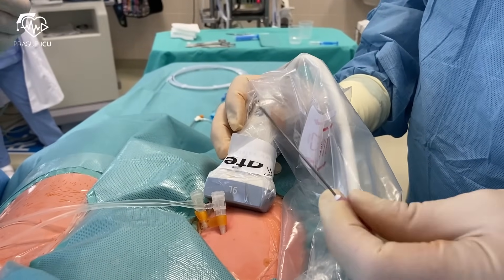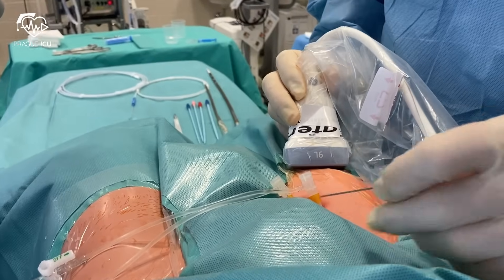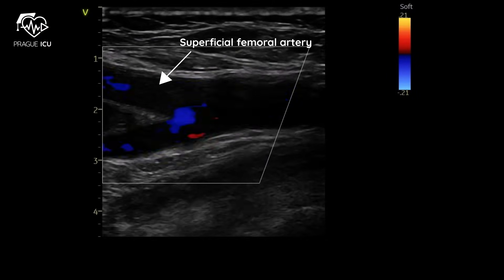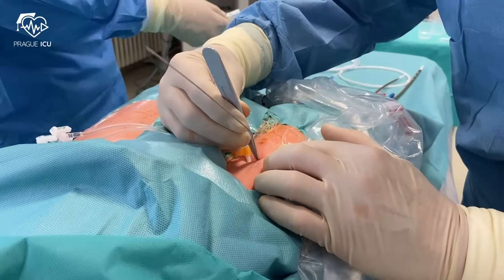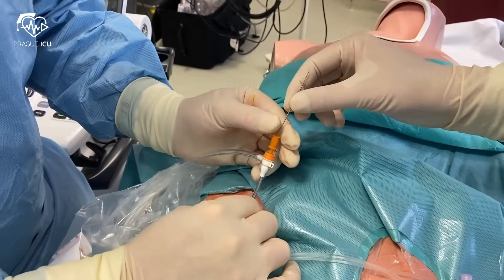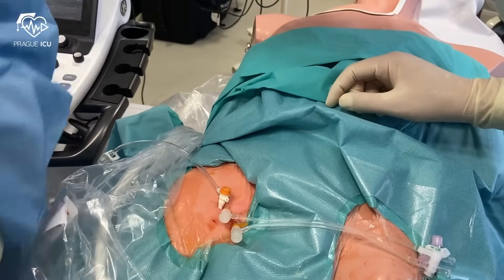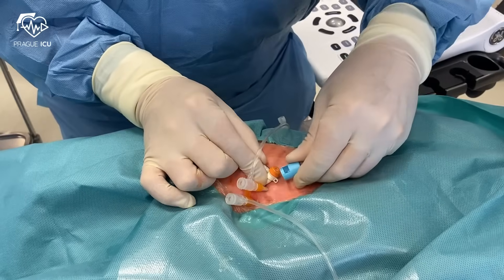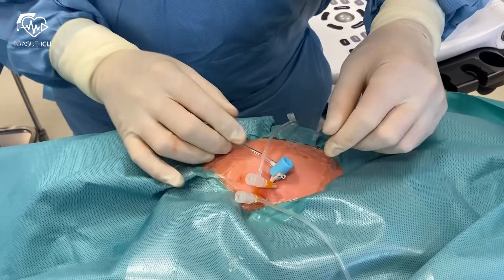Ultrasound is always used for the insertion of a reperfusion cannula. We recommend placing the reperfusion cannula close to the arterial ECMO cannula to prevent thrombosis in the segment between them. Once you enter the superficial femoral artery, insert the wire. Make a superficial incision at the entry point of the wire, which will facilitate the passage of the cannula. Avoid bending and kinking of the wire. Then remove the wire and the introducer, unclamp the cannula briefly to flush the lumen, and apply the cap on top. During ECPR, leave the reperfusion cannula insertion until the end of the procedure, once the circulation is restored.